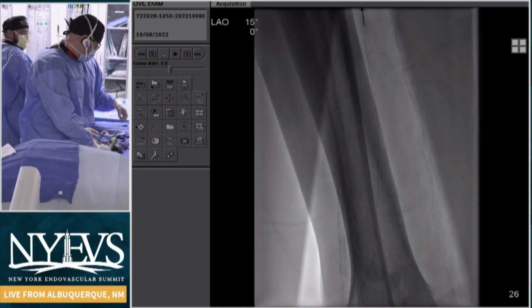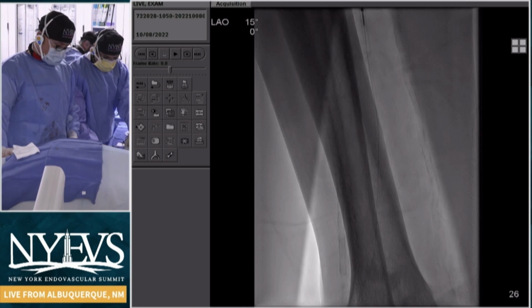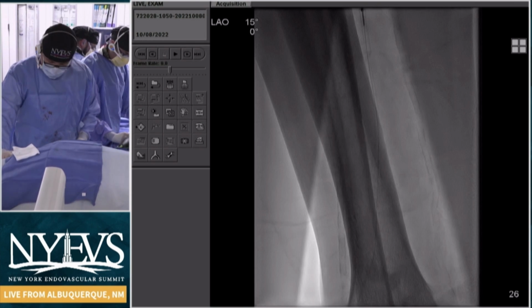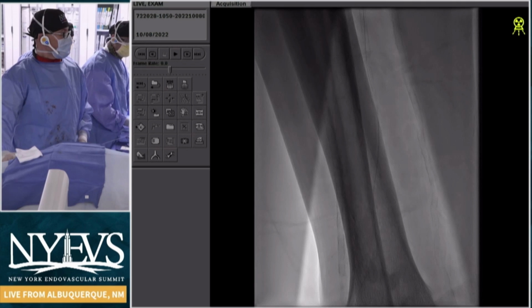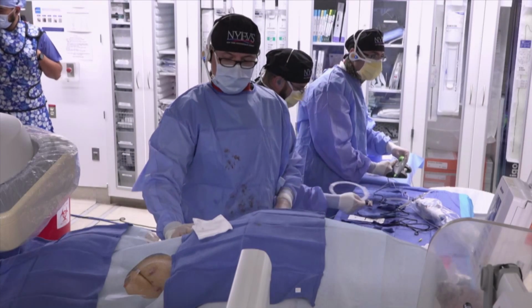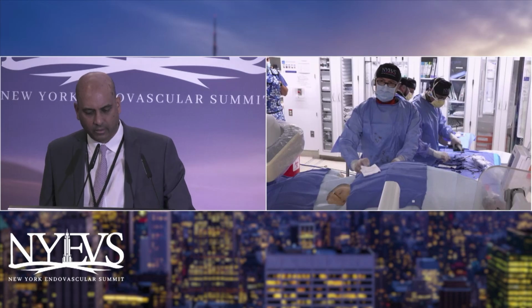And I think that's where we're still learning a lot, right? CLI endpoints, when do we stop? How much do we do? I think you see it even in deep venous arterialization. How much of that plantar venous arch do you reconstruct? How much flow do you have to get? They always talk about reflux into that Lejar's venous plexus, right? Because you've got to fill the subcutaneous and the dermal veins and so forth. So, yeah, point well taken.